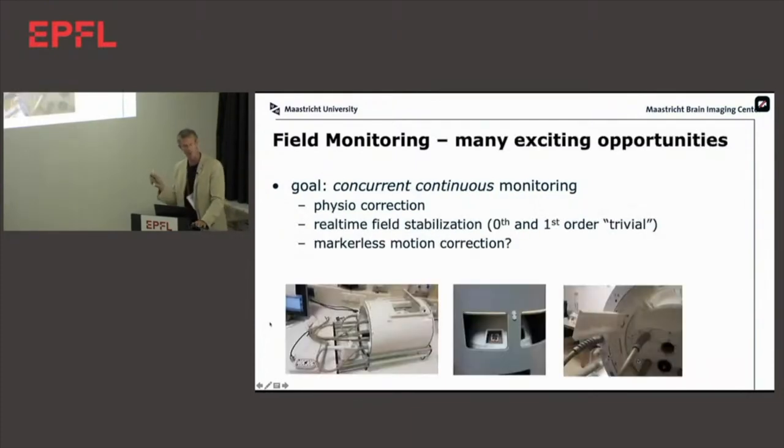and actually Scope, just to advertise it a little bit, they have a very neat solution for this now, where you can actually fit the probes into the Nova coil in a sweet way, so certainly the Siemens version of the Nova coil. We have our own coil, which looks like this. We haven't used it really yet, but we have these little tray things that Chris Wiggins in Maastricht literally just printed yesterday, to fit the probes around for different positioning that you want.